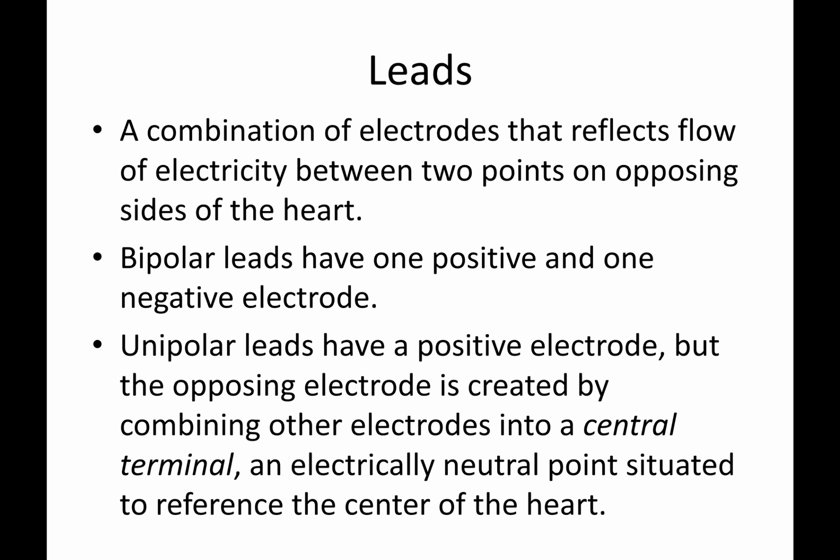So, basic reminder, electricity flows from negative to positive, so that we are measuring everything from the positive end. The positive end is where we're looking at the heart from.